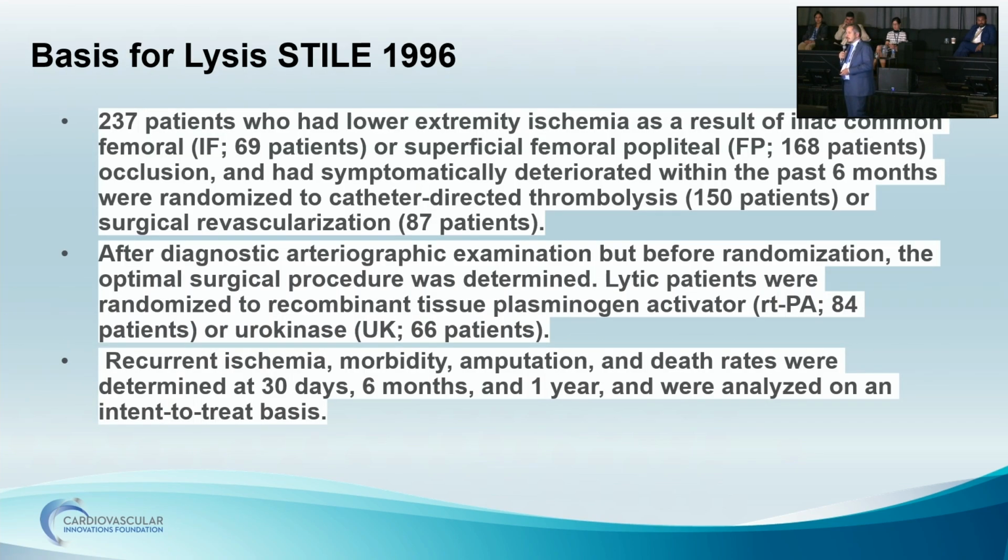There was a paper called the STILE study in 1996, a very interesting and important paper to understand. In this paper, they studied 237 patients with a thrombotic lesion, which can be femoral, iliac, or popliteal, comparing catheter-directed thrombolysis versus surgical revascularization.